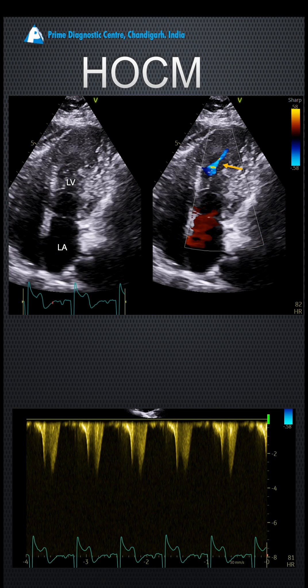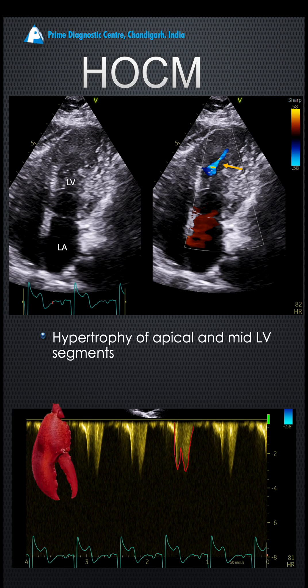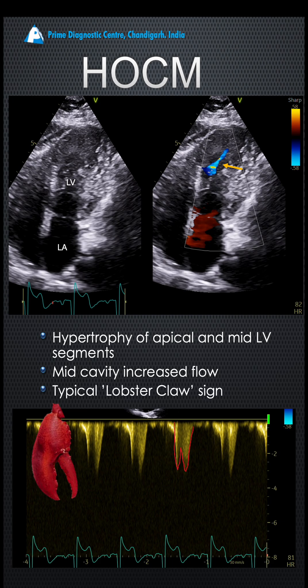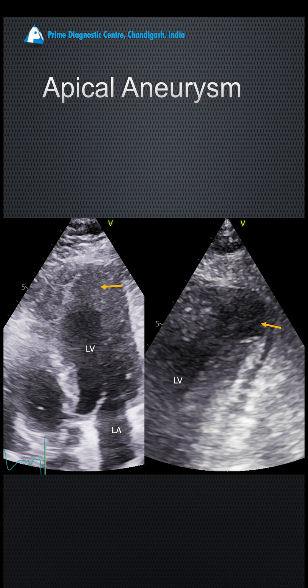If you do a Doppler there, you can see there is a lobster claw appearance of this flow, which is typical of hypertrophic cardiomyopathy. So this is hypertrophy, you have mid-cavity increased flow and a lobster claw sign indicating this is hypertrophic cardiomyopathy.